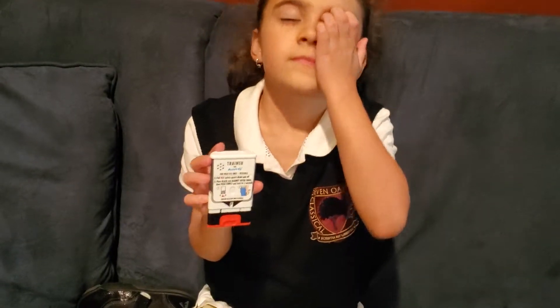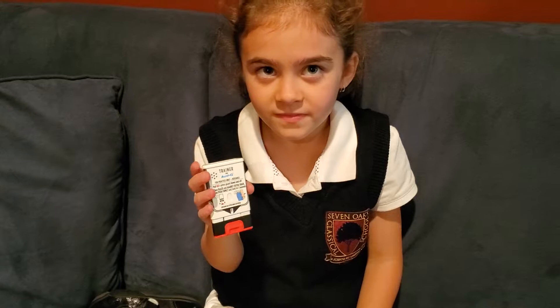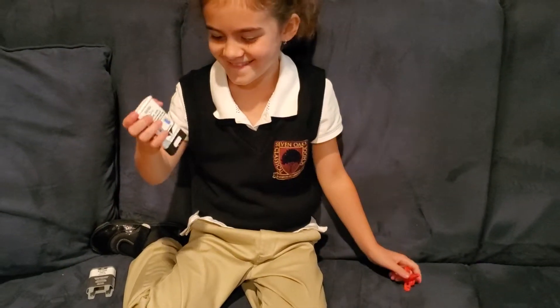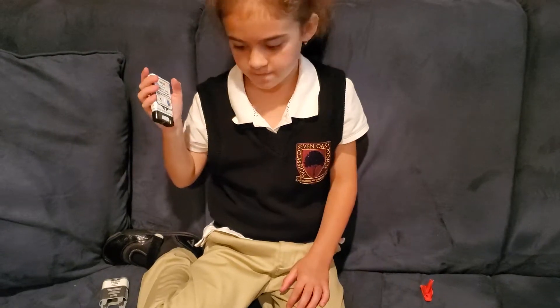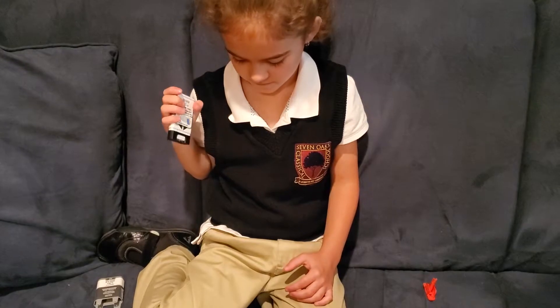If you are ready to use, pull the red safety guard down and off of this trainer. Then place the black end against your outer thigh, and push firmly until you hear a click and hiss sound.